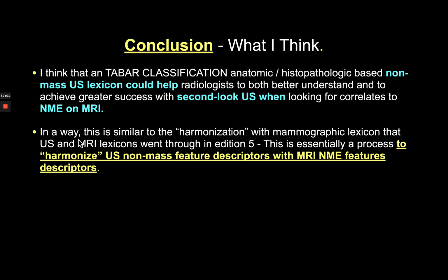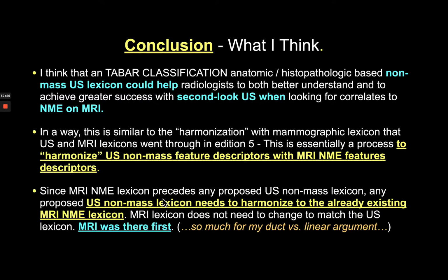And the MR lexicon existed first, so if we're going to quote-unquote harmonize ultrasound non-mass features with MR non-mass features, we in ultrasound are going to have to flex to match the lexicon. So even though I made a big stink about how I can tell a duct from a non-duct, if we're going to harmonize with MR, which uses linear versus non-linear, we might have to use that terminology for ultrasound as well.